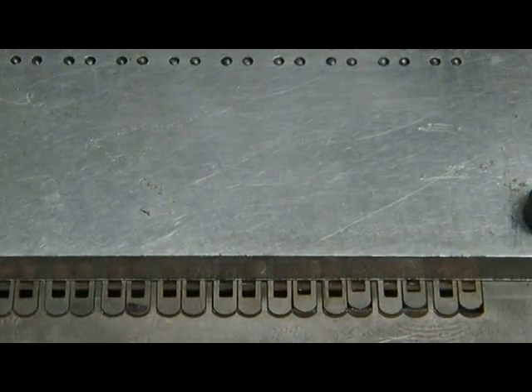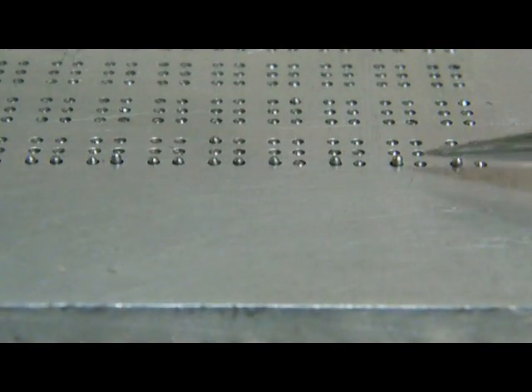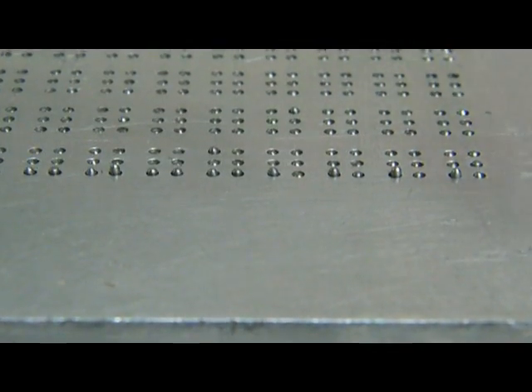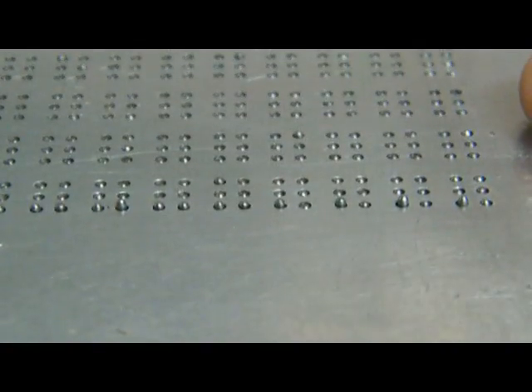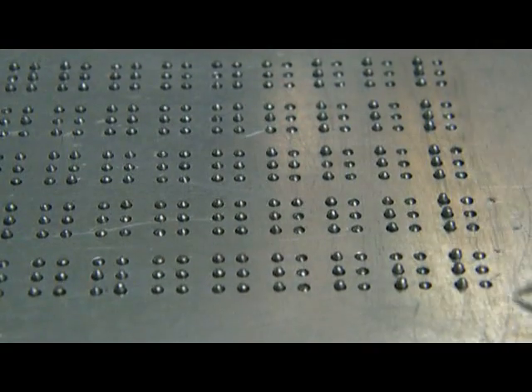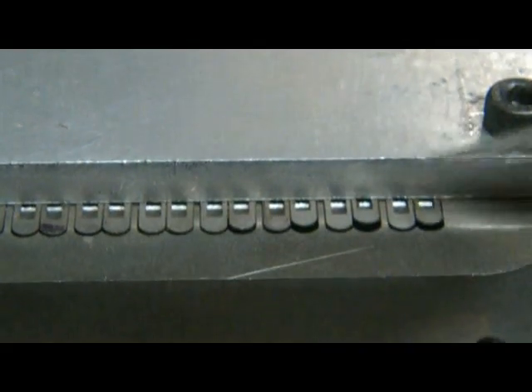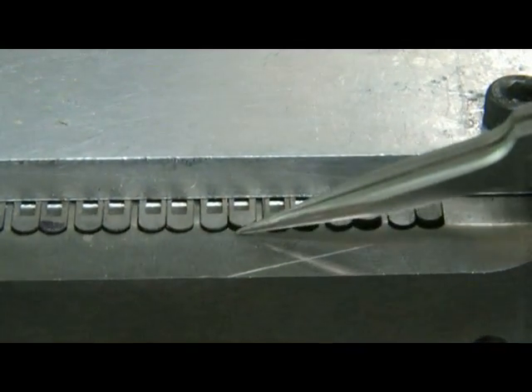So when I trigger it, the first pins of those particular columns are disabled. I think you can see them over here. This one, this one, this one. The entire column is basically disabled. So although I'm actuating all the things, those columns are latched, so the pins don't really move in those latched columns. If you look carefully, it's just the first column of each cell. This one, and that one, and that one. These first 4 cells, they are latched shut. You can see them here. This indicates the latch shut. This gap here, gap here, gap here, gap here.